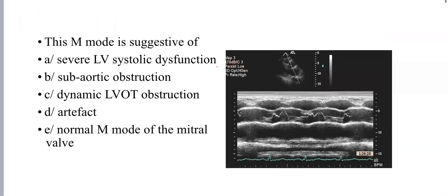Easy one. So what do you think? LVT, nice. LVOT obstruction. Dynamic LVOT obstruction.